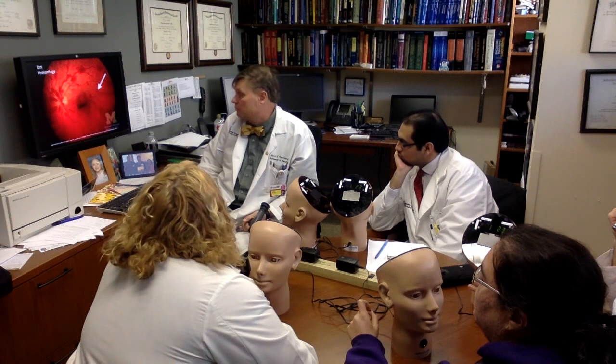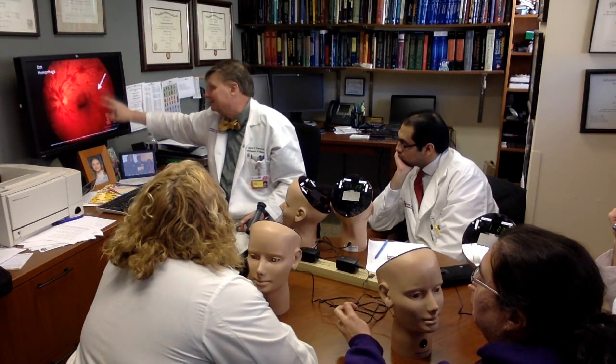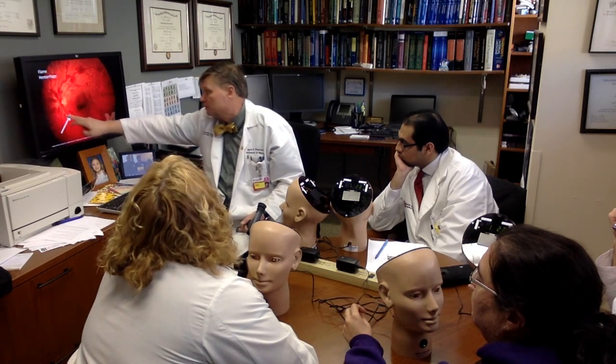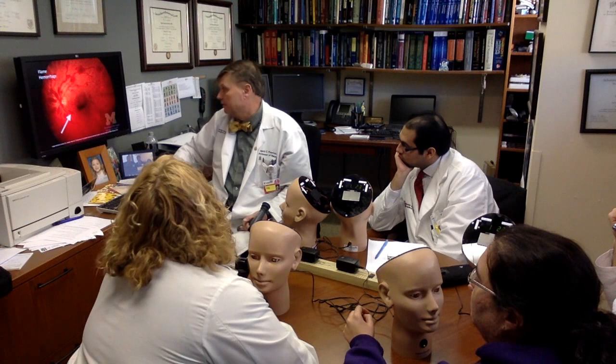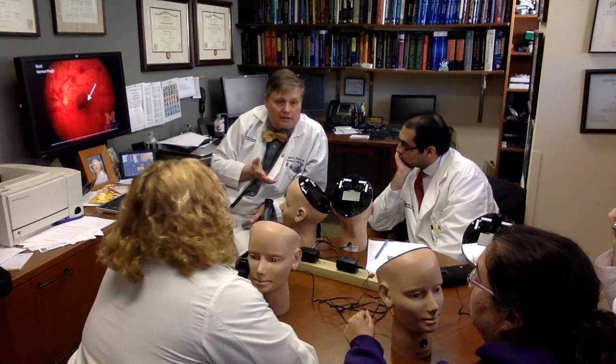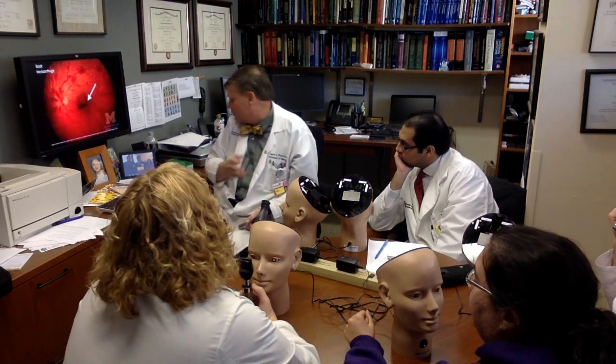So here's one who has multiple retinal hemorrhages. All these are dot and blot all over. However, here is like a flame-shaped hemorrhage. Okay, and then here's our boat hemorrhage. So we should be able to recognize major hemorrhages. How about that? All right, the dot and blot, flame, or a boat-shaped hemorrhage.